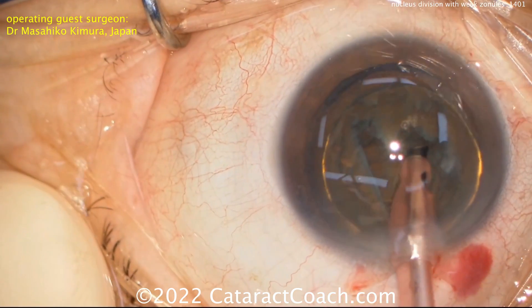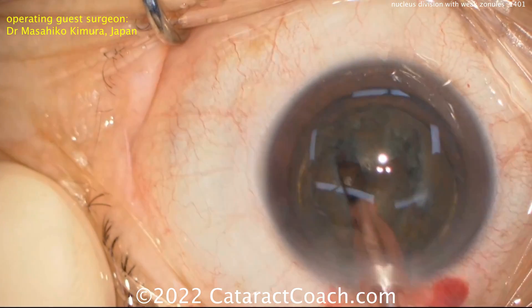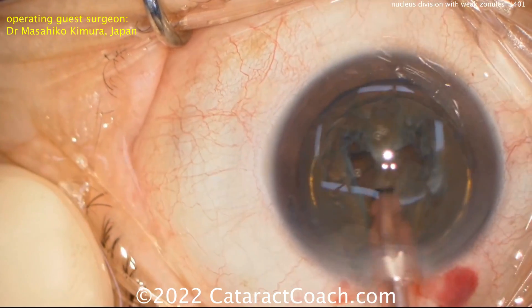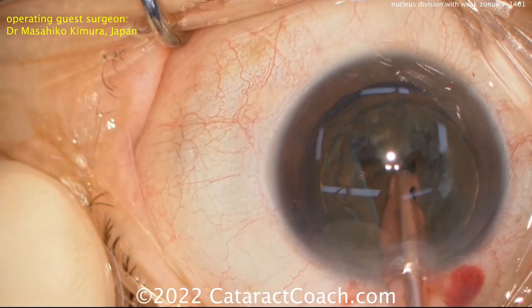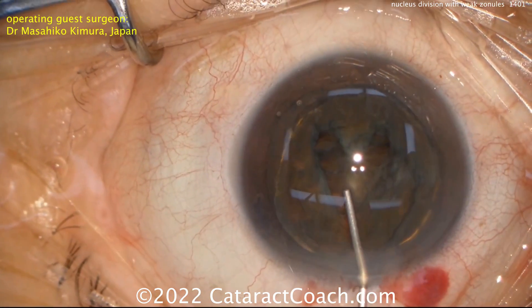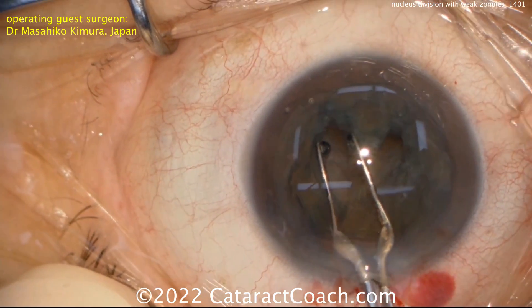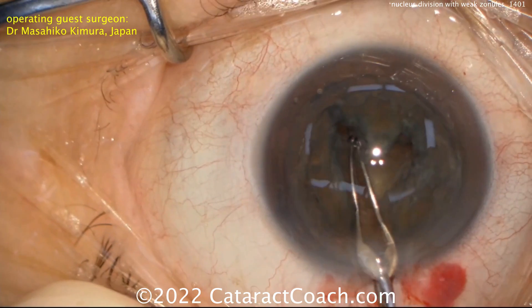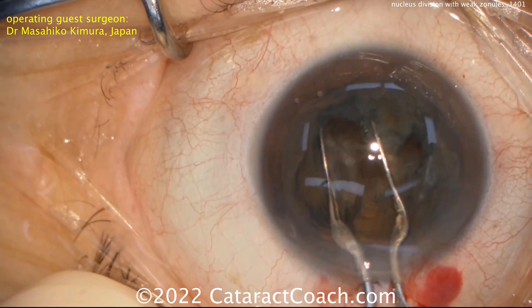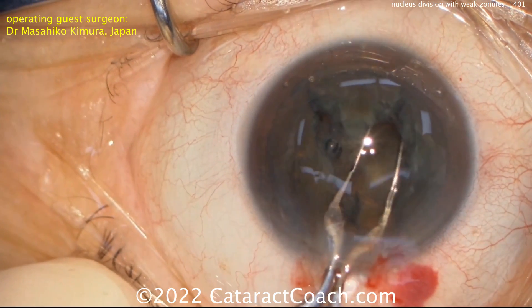You saw the video from Tom Oding from Iowa, who says to use this technique in a case where you have an intravitreal injection that has damaged the lens capsule — you want to avoid hydrodissection and avoid manipulation of the nucleus in the bag. So here, once the V-groove is created, the pre-chopper can be used to just split these pieces. You could also use the phaco probe and a second instrument like a chopper to do the same technique of splitting.